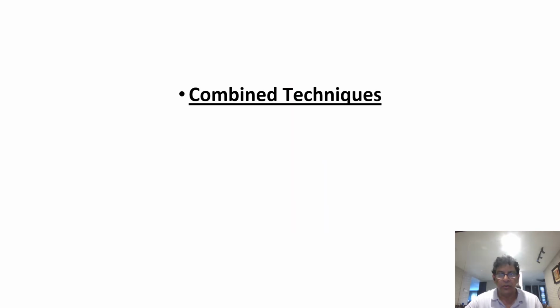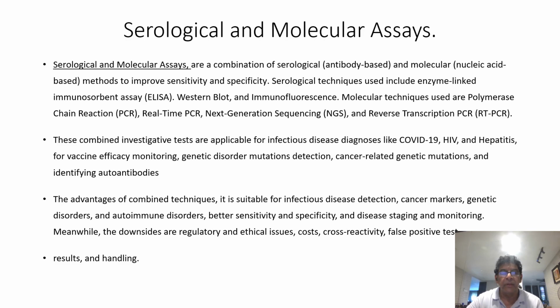Next is the combined techniques. The combined testing involves serological and molecular assays. This combination of serological, which is basically antibody-based, and molecular, which is nucleic acid based, improves sensitivity and specificity.